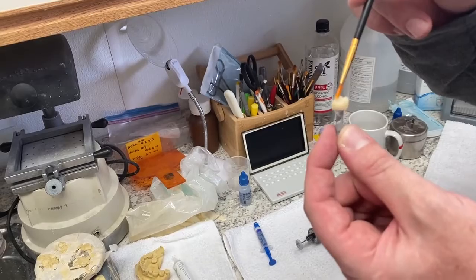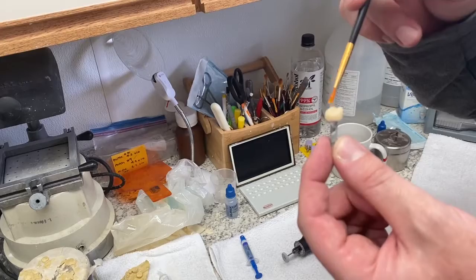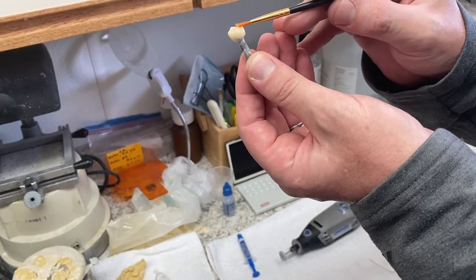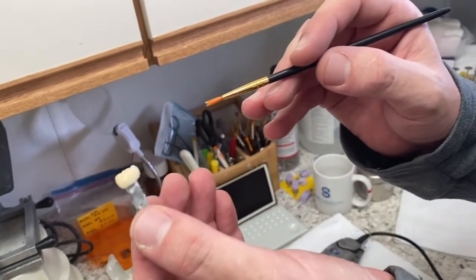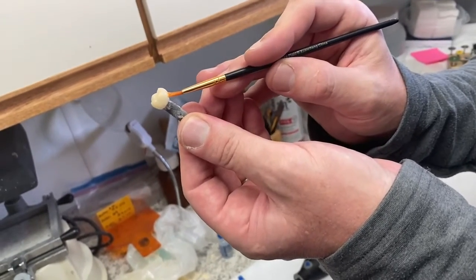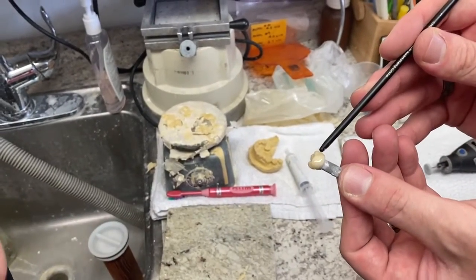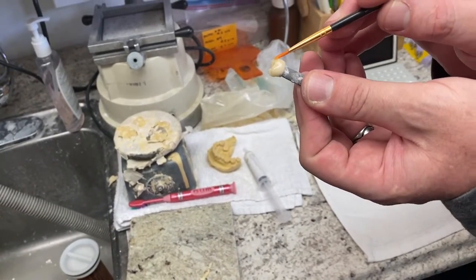Okay, I would start on the occlusal, brush across the occlusal, and then you can start down the sides. So you start at the occlusal edge and pull down. And you're just watching it glisten. So you want it to seem very, very shiny. And you can't miss any spots, right? You figured that out. So if you look here, it's nice and shiny there, it goes a little dull, and then it's back to nice and shiny, right? So I know that I missed this little spot right in here.